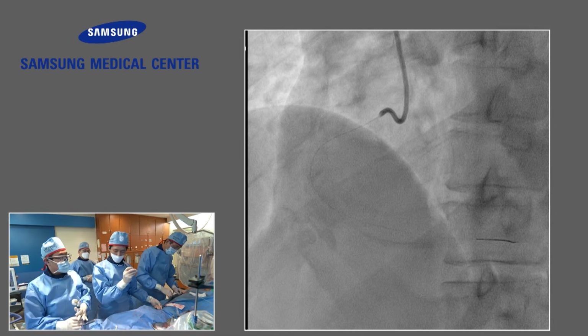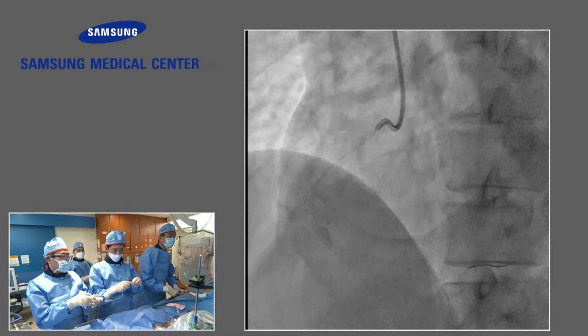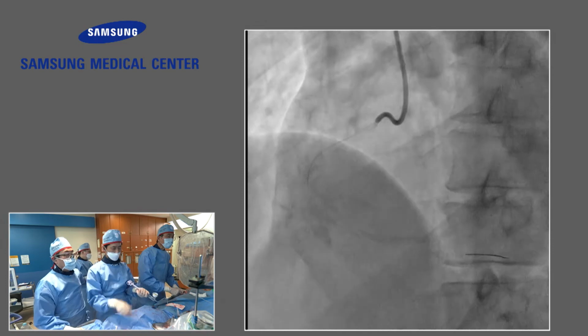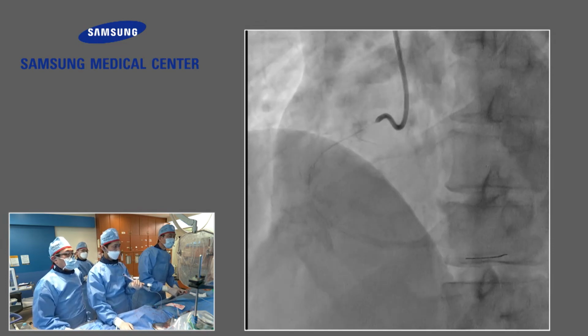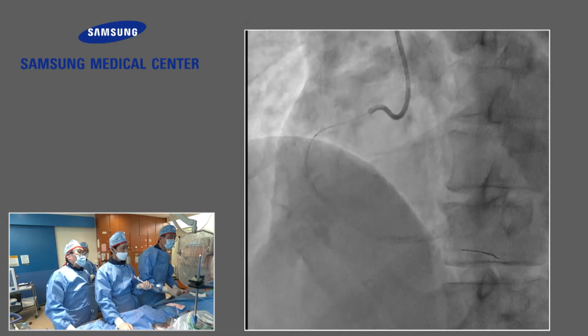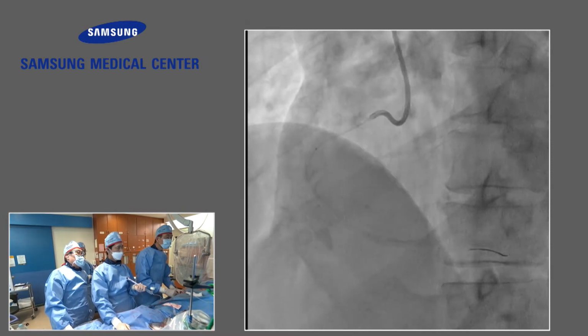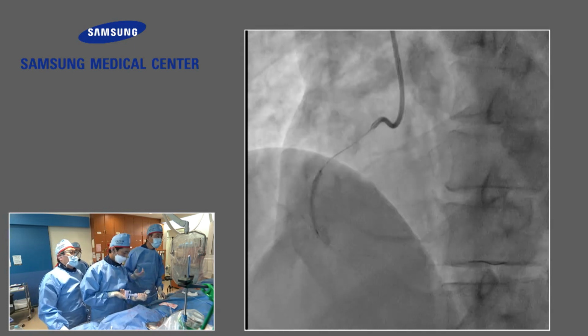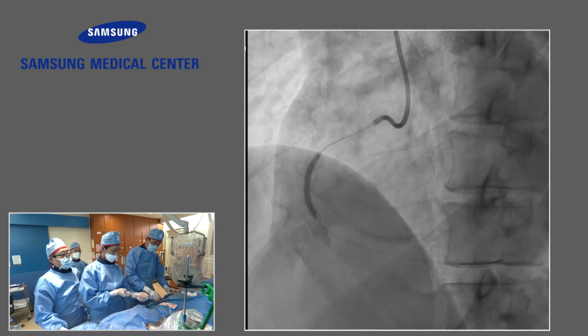The CTO segment is not calcified, not so hard. So many times we don't know exactly when it starts. Probably the anatomic course would be critical stenosis progressing, and then recently, maybe 10 or 12 months ago, it became totally occluded. Yeah, maybe that's right.